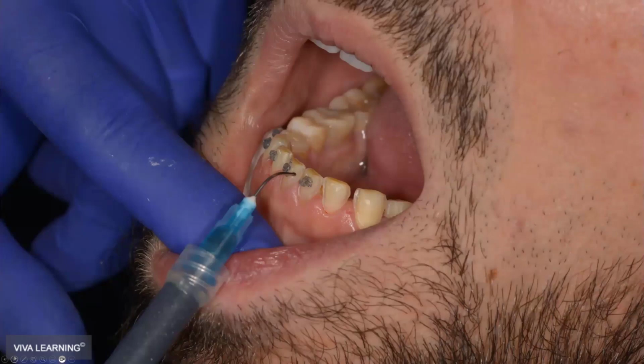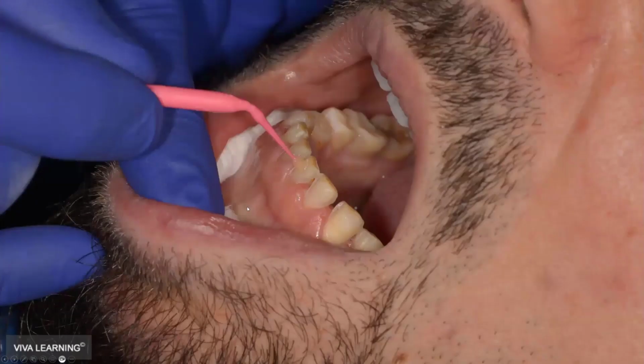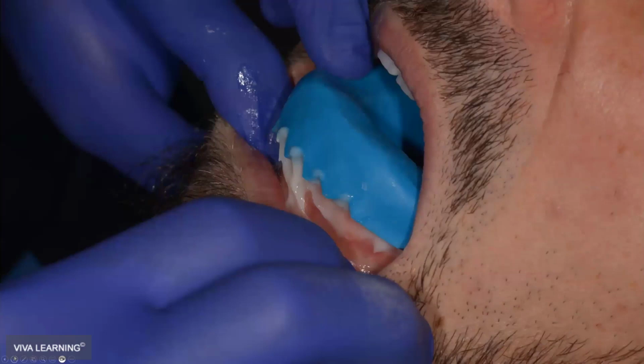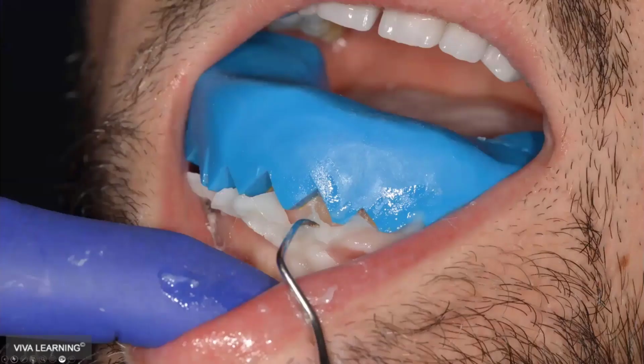And then at the bonding procedure, because usually it takes about 10 days for the final veneers to be ready, we decided to spot etch the teeth, and when we make the provisional veneers after the mock-up, I want them to be spot etched, just to be able to hold them in place as long as the dental technician is working on the case.